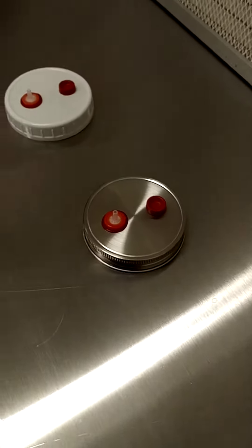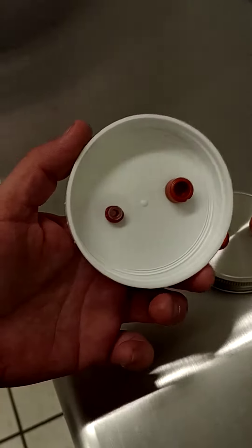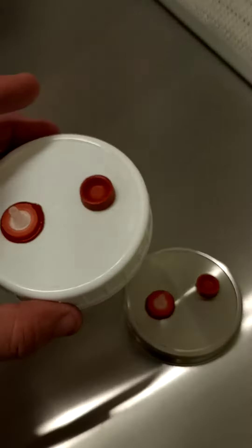What up everybody, this is Matt from liquidfungi.com and today I wanted to go over the difference between the two lids we sell. This is our traditional RIT lid and you see a lot of people sell lids like these made of polypropylene plastic.